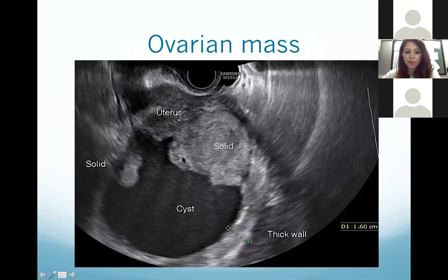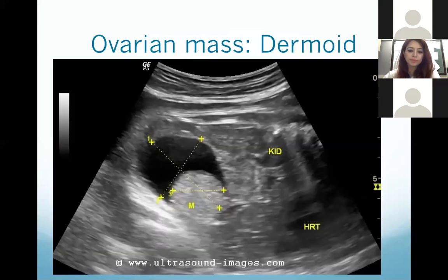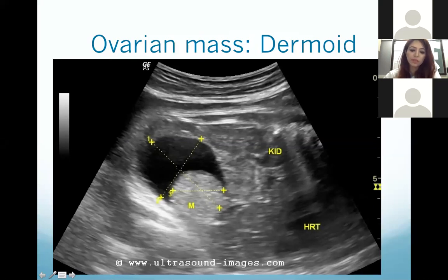This is an image showing an ovarian mass with both solid and cystic components. As mentioned, any fluid seen on ultrasound is black, so this is the cystic component of the mass, and this is the solid component — making this a complex solid-cystic mass. This other image of a solid-cystic mass is a dermoid, because you can see a fat density signal: the white area is fat and the black area is fluid.